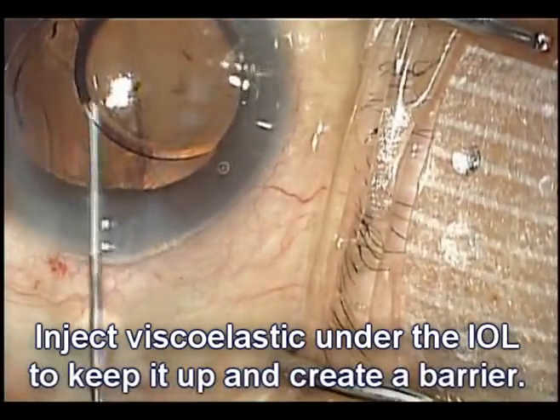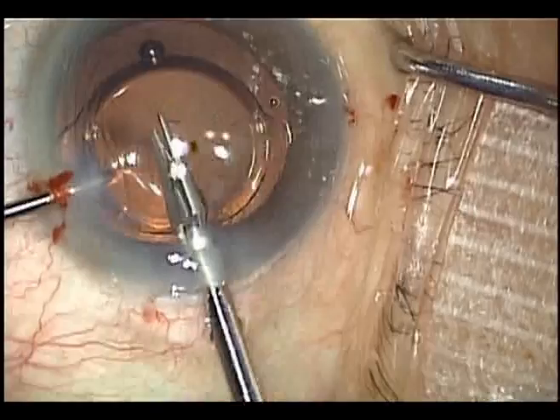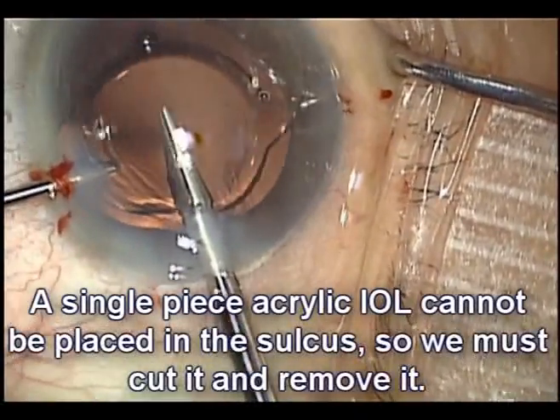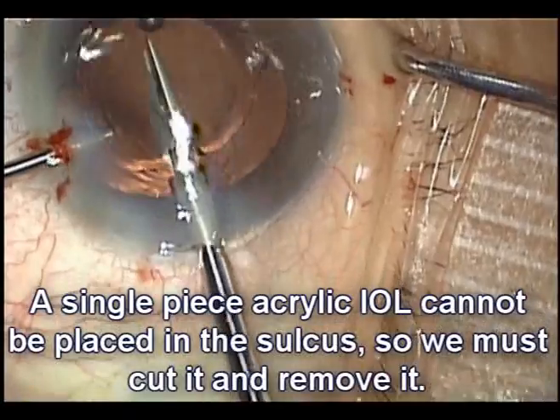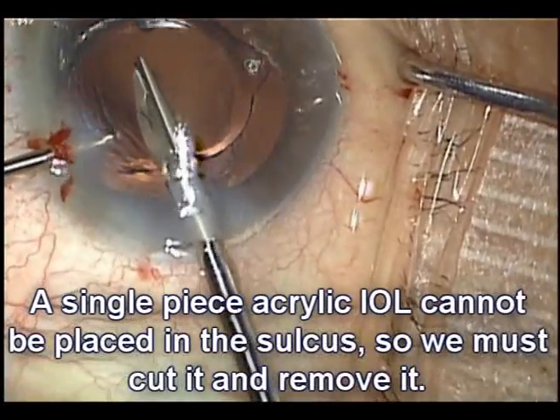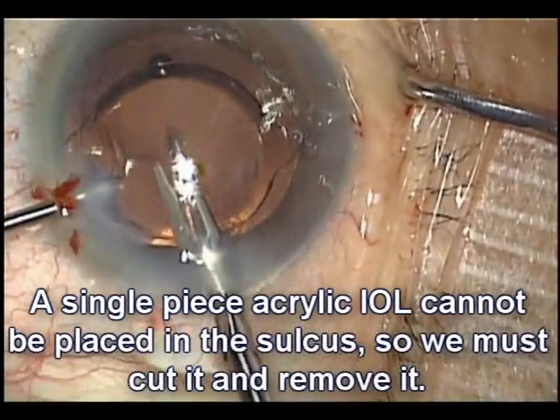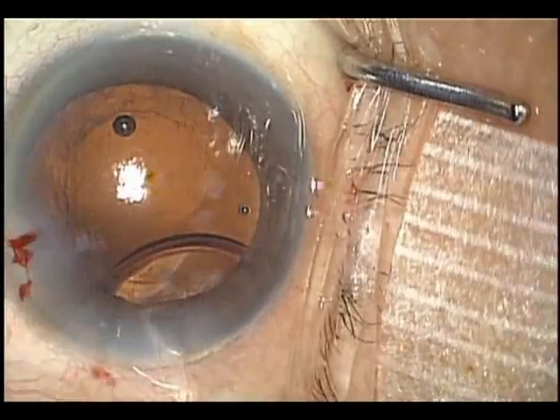There's the lens nicely brought up into the anterior chamber. Certainly we can't leave this lens in the capsule, and we certainly can't leave it in the sulcus. We're going to cut it in half to remove it. I usually cut the lens about 80% of the way through — then we can remove one half, and the other half, which is still attached, will follow. So that's what we're doing here. Remember: never place a single-piece acrylic lens in the sulcus.